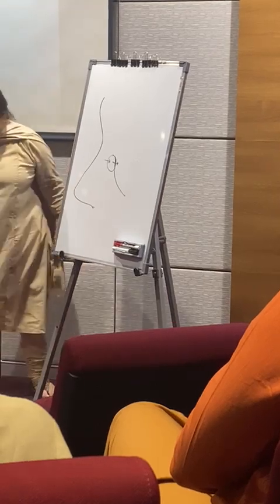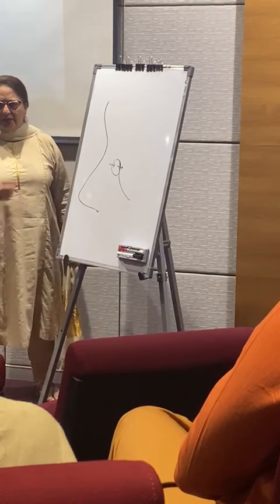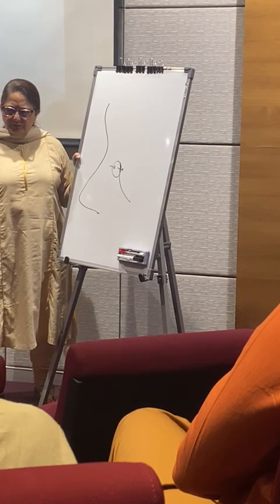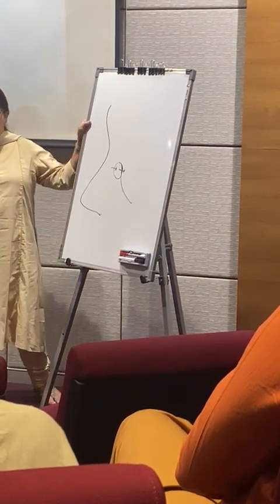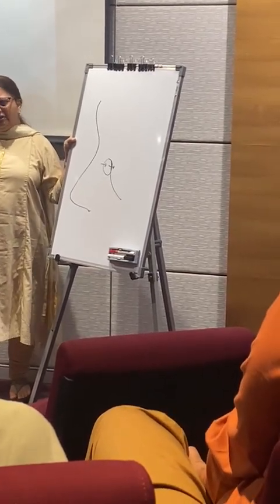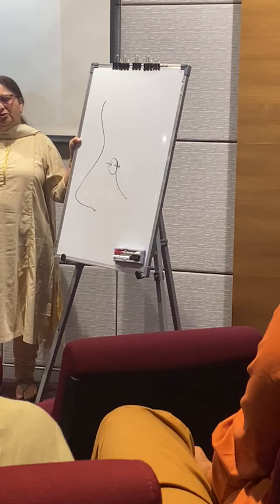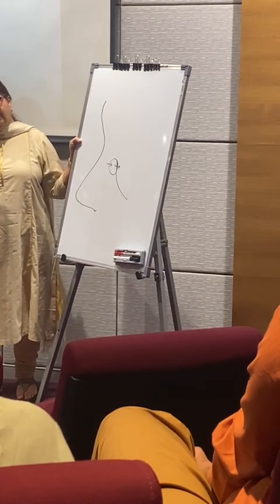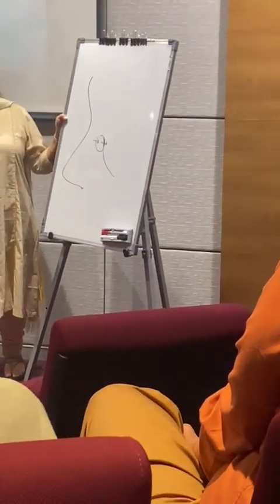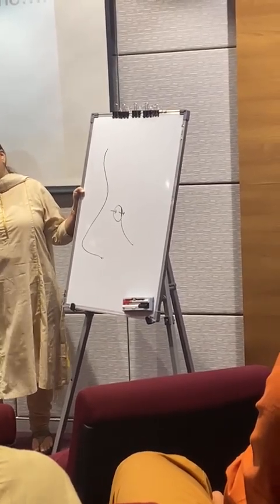In this condition, while we are removing the vertical part of the uncinate process by using a polypod, it might be possible that we are also damaging the posterior wall of the agger nasi. Yeah, so what you're doing is, first of all, if there's an agger nasi cell, go through the agger nasi cell. Don't try and find the uncinate. So if you're going through the posterior wall of the agger nasi cell, yes, there's a chance that you're actually going through the uncinate also. So that is what you need to know, when you're removing the cell and if you don't see an uncinate, that's because both of them were fused, and when you remove the posterior wall of the agger nasi, you also remove the upper part of the uncinate.